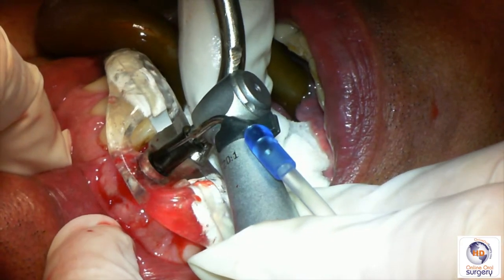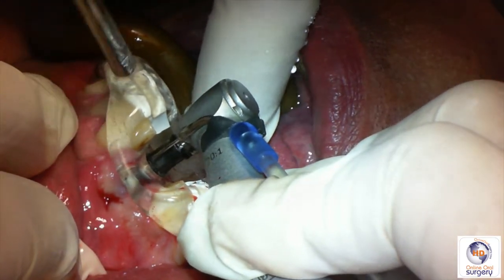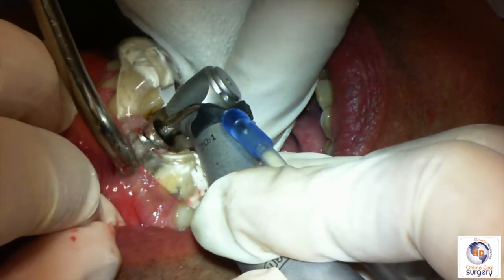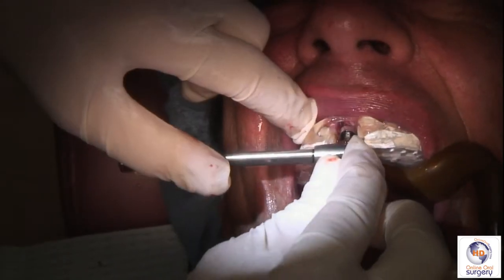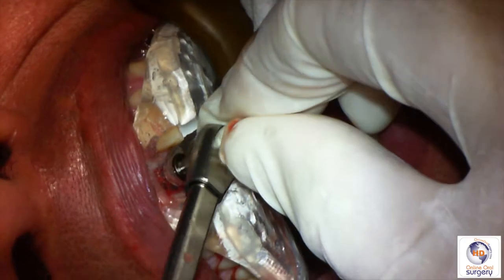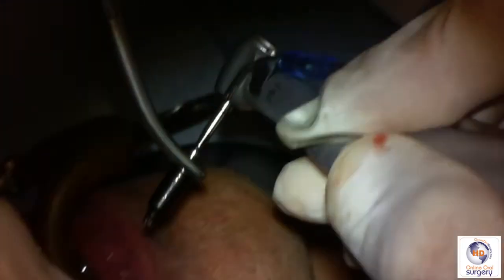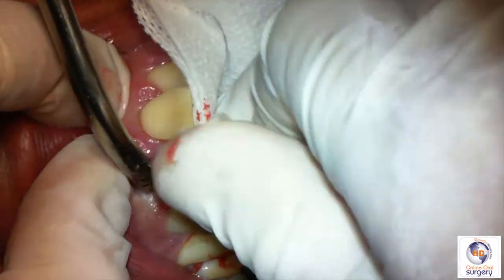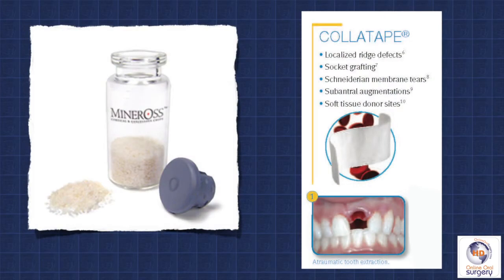Once the osteotomy has been prepared, we deliver our implant through the surgical guide — this is what we call a fully guided technique. If we had taken out the surgical guide and placed the implant freehand after doing the osteotomy, that would be a partially guided technique. But this is fully guided, so the implant goes through the guide itself also. We take it all the way down to depth using copious irrigation. With the handpiece, I stop about a half a millimeter shy, and then we take the hand torque wrench to finalize implant placement. On the implant mount there are timing marks that allow us to set the rotational positioning of the implant. We remove the implant mount and then the surgical guide itself — the implant is now in place, perfectly positioned. There's a gap in the bone between the alveolus and the implant itself, but the implant is stable and perfectly positioned.